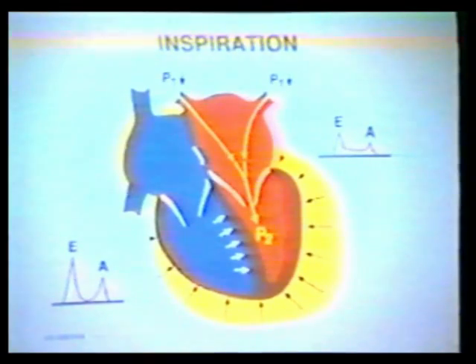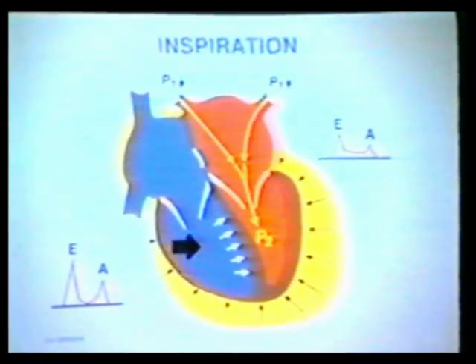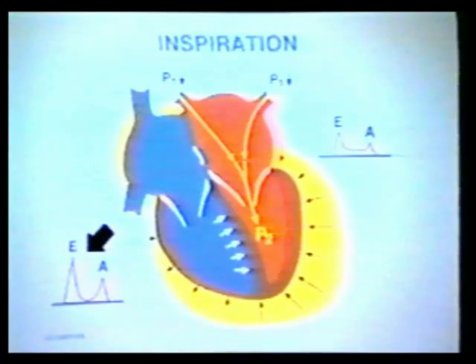With decreased LV filling, the ventricular septum shifts to the left. This allows for an increased volume to flow into the right ventricle, and this is reflected by the increased tricuspid velocity integral with inspiration.